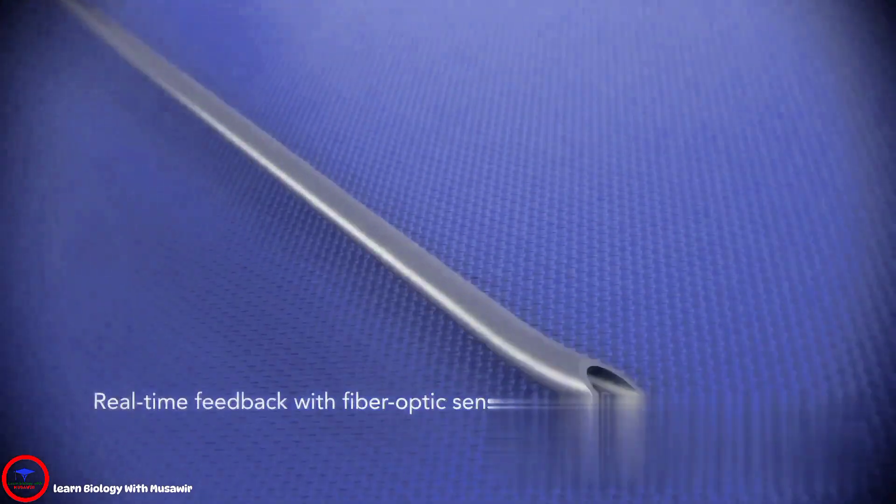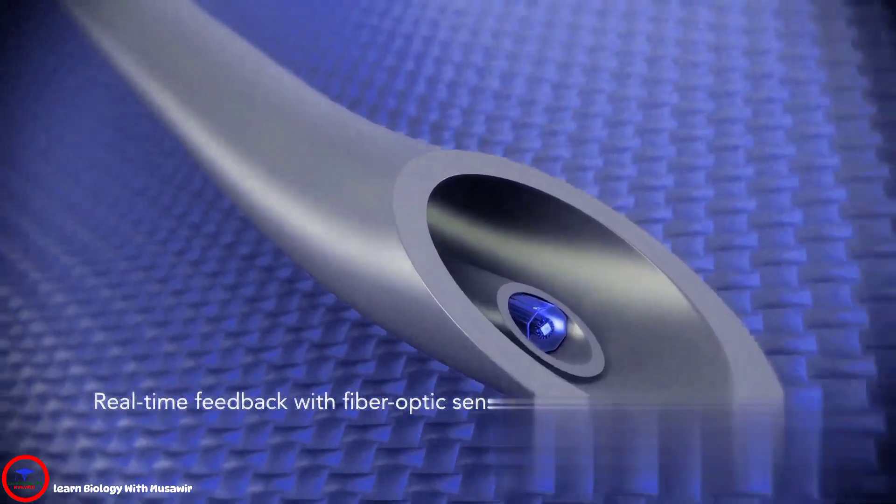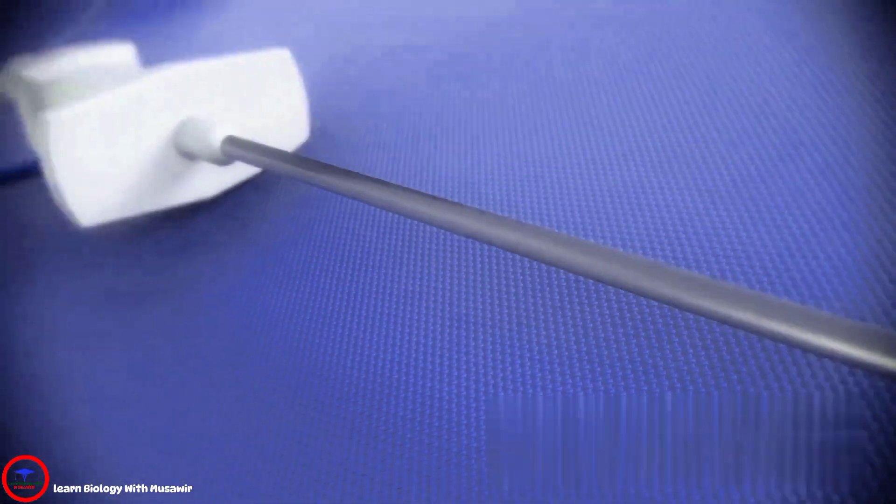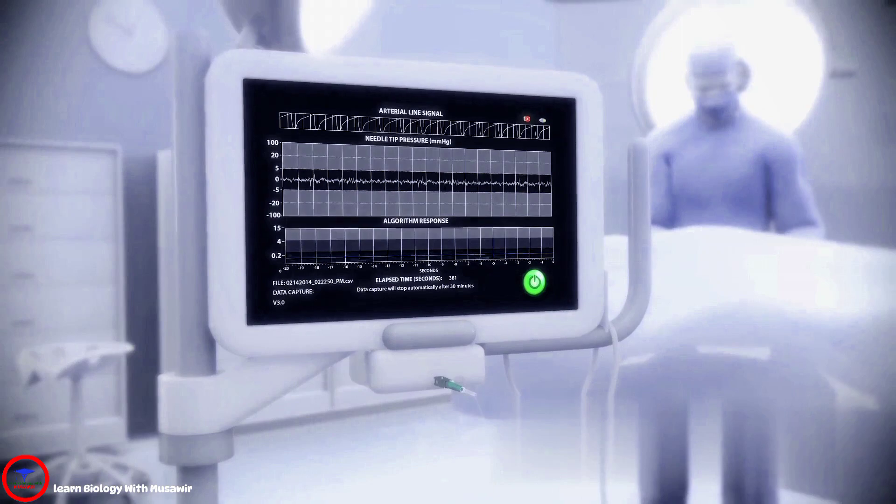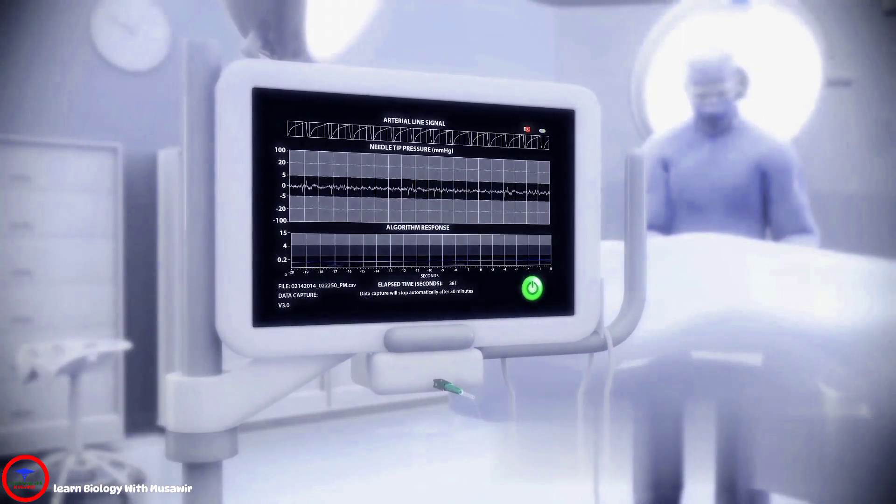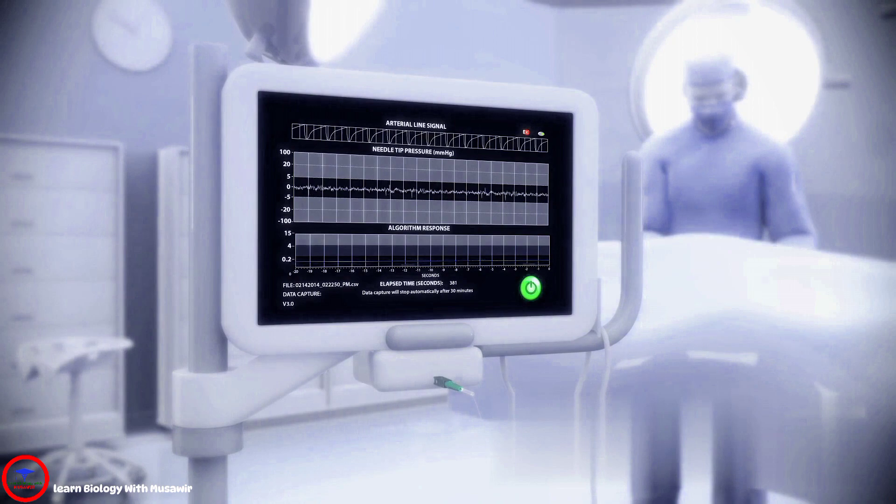The Smart Needle's fiber optic sensor provides real-time feedback on the needle tip location. Proprietary algorithms analyze and display pressure frequency data in an intuitive manner. Combined with image guidance, this information is designed to increase clinical confidence for safe epicardial access.